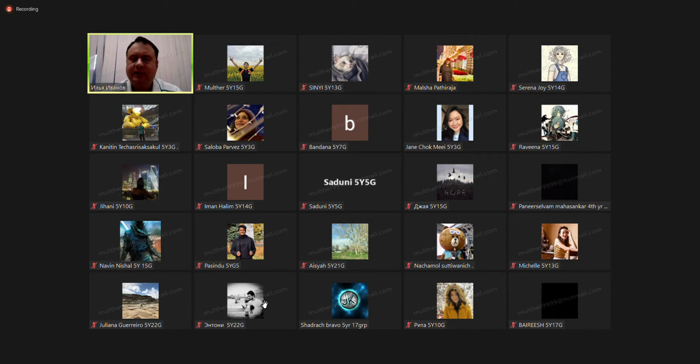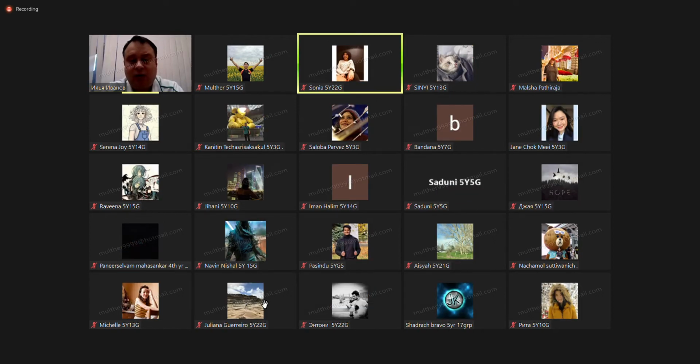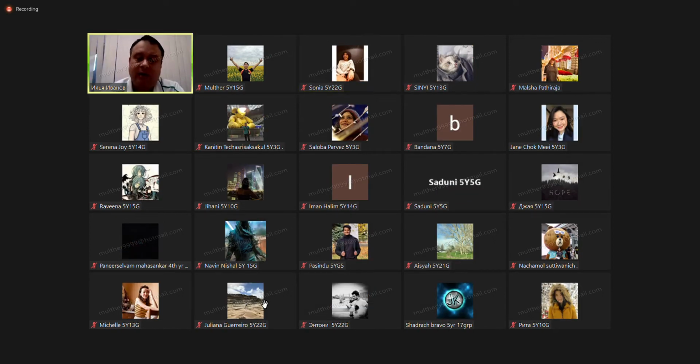We can find this symptom in case of the investigation of pancreatic stones and urological stones. The same symptom of the distal acoustic shadow we can find in case of metal objects in the body of the patient.